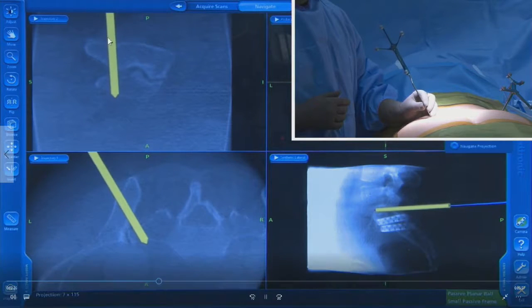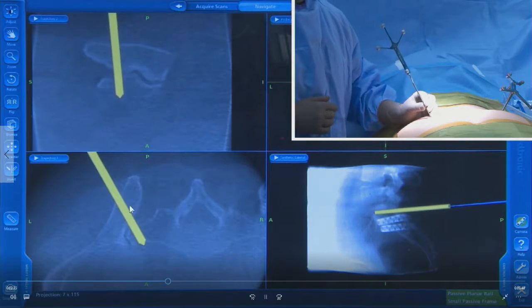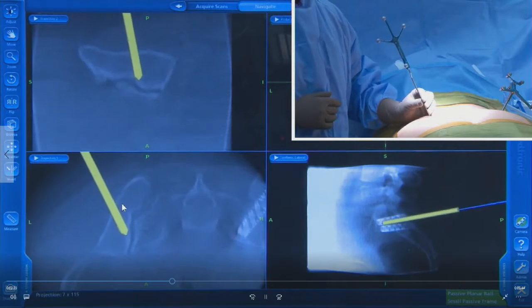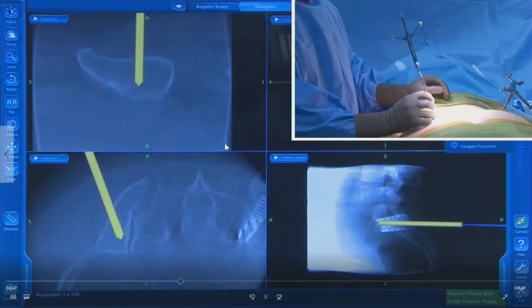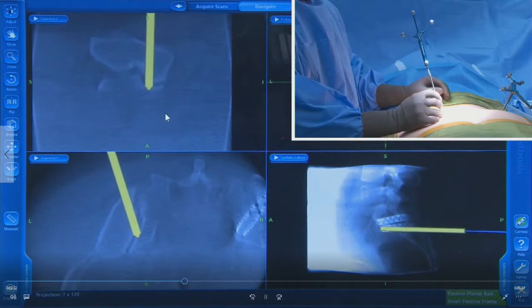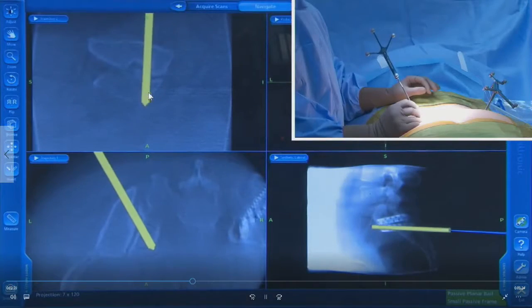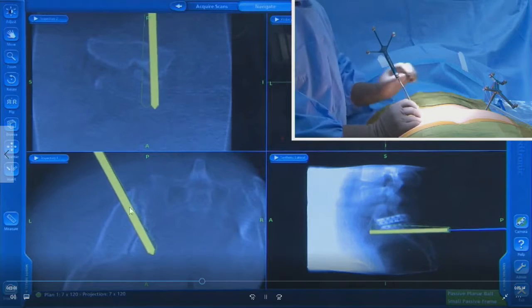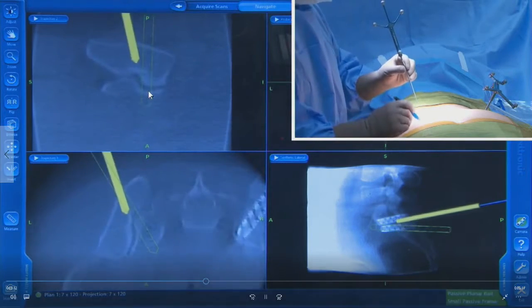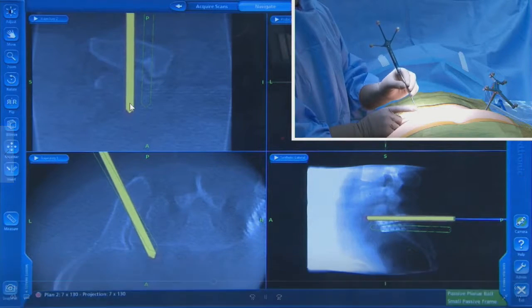What I'm doing here is looking for a spot where I can put my first implant, giving myself enough space to put the second implant. I want to cross the joint in a particular area, capturing enough iliac bone and enough sacral alar bone. At some point we'll use the O-arm software to place a plan — a virtual K-wire, if you will — and you'll see that plan as a hollow colored box showing up in just a second, representing where the first implant is going to go. Then I can plan for the second implant next to that with a similar trajectory.